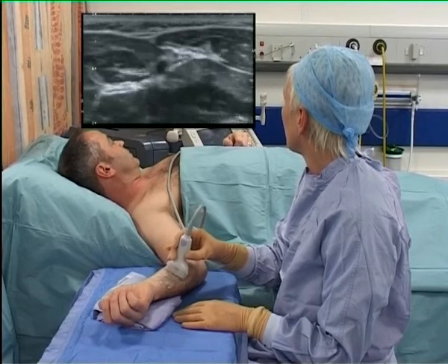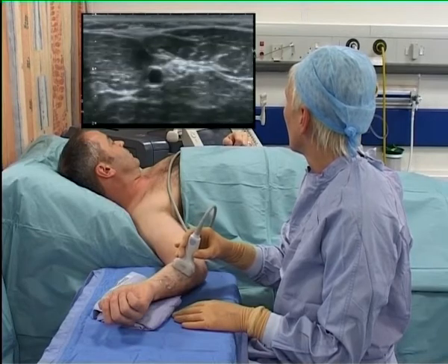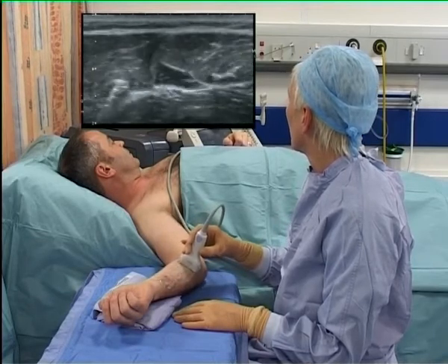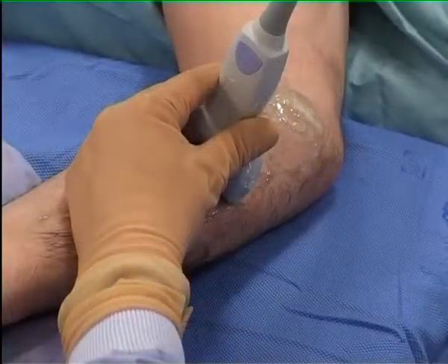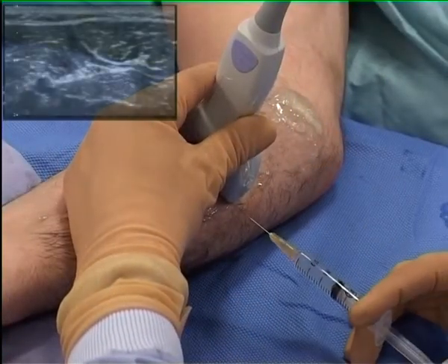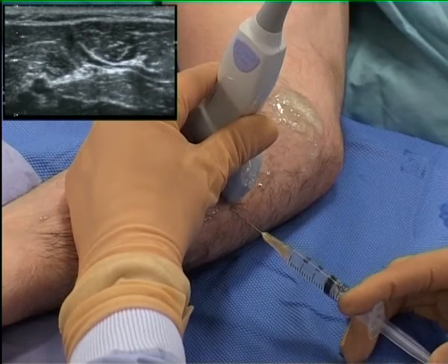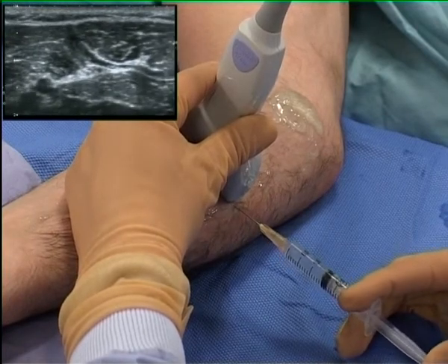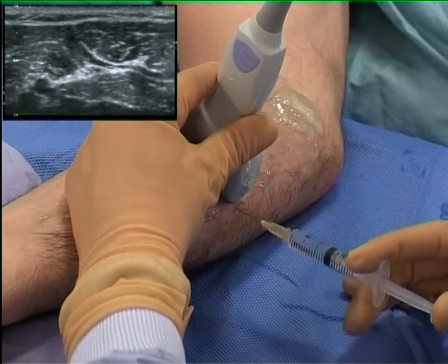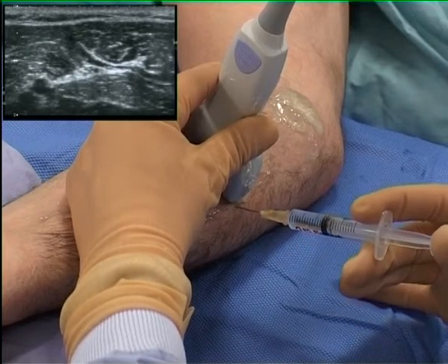As the probe moves proximally towards the antecubital fossa, the artery drops deep and the nerve remains superficial. The best transverse ultrasound image is generated. The scanning hand rests on the table to maintain a stable image, thus allowing the puncture site analgesia to be appropriately placed in the midline of the probe.